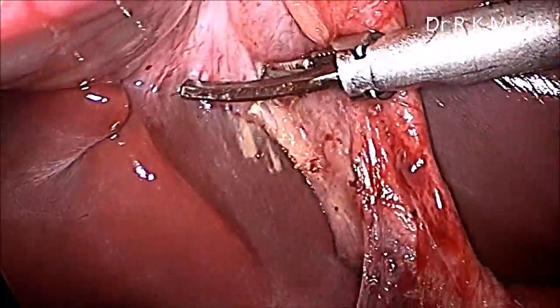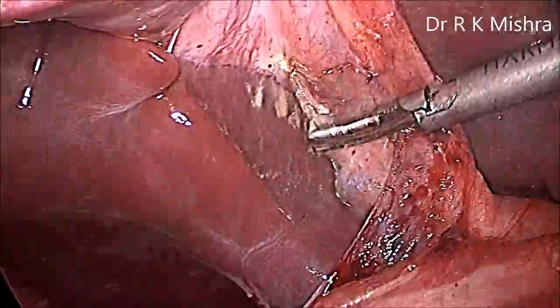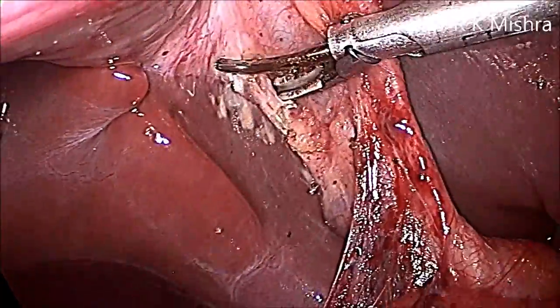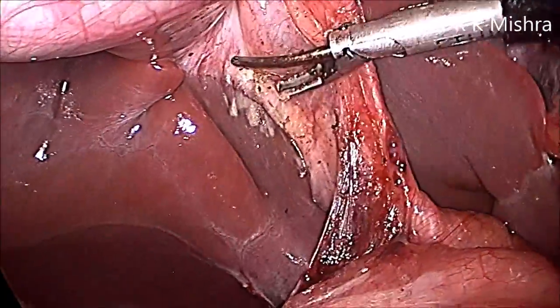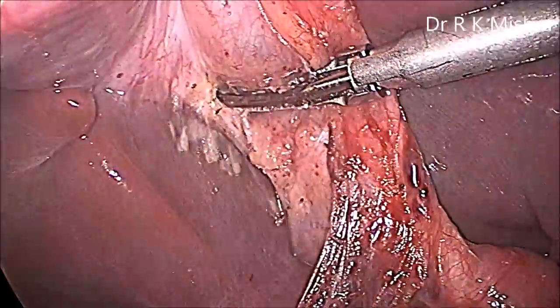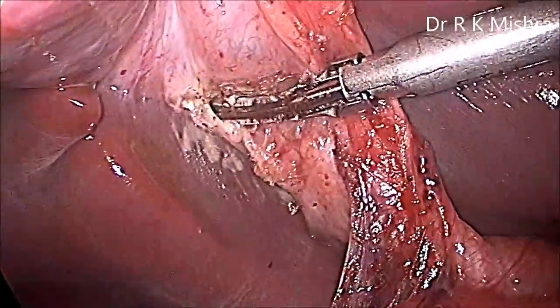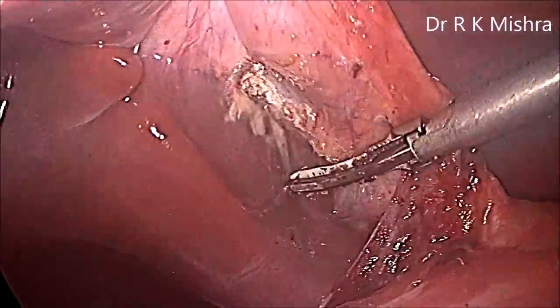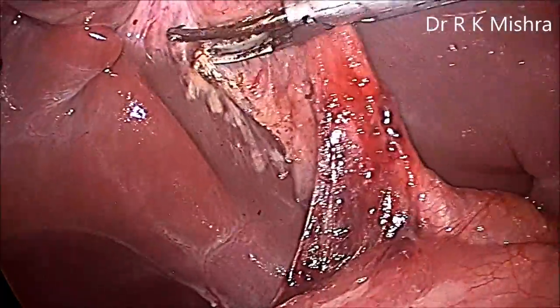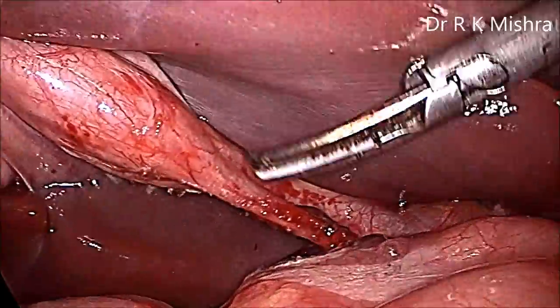The silicon jaw of the harmonic is kept towards the gallbladder so it does not have any knocking effect and cannot transfer any vibration to the gallbladder. This is the angle of the cystic duct with the body of the gallbladder — what we call the mouth of the elephant. You can separate the posterior peritoneum very carefully. At the same point, give anteromedial traction to expose the posterior peritoneum, and after opening it, start giving anterolateral traction.